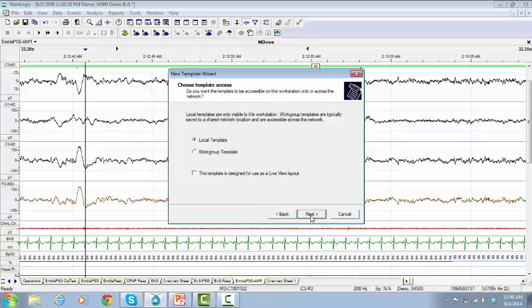If you want this template to be accessible for each PC in the sleep lab, select Working Group Template. If you don't have an internet network, then select Local Template.